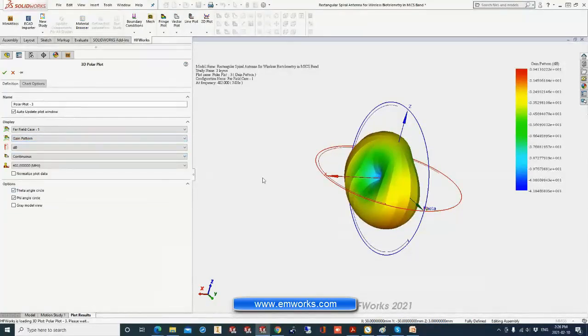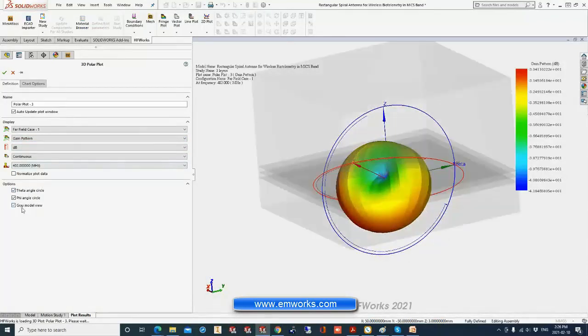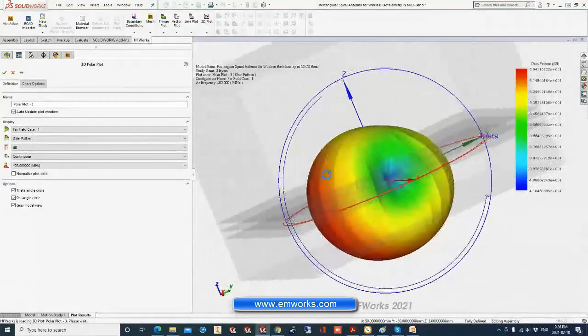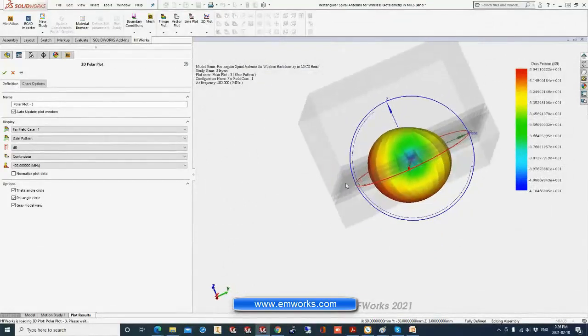Gain pattern. So this is the gain of the antenna at this frequency, and we can superimpose it with the 3D geometry also to see the direction. It is expected that the direction of the antenna will be like that.